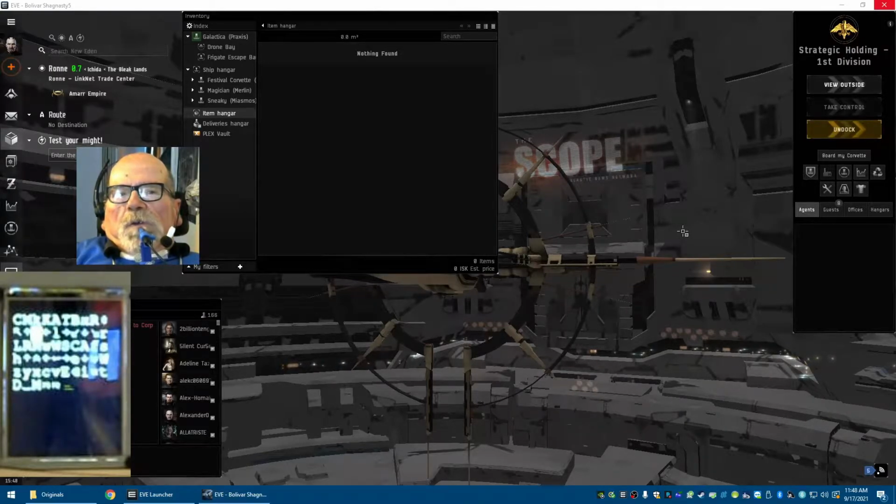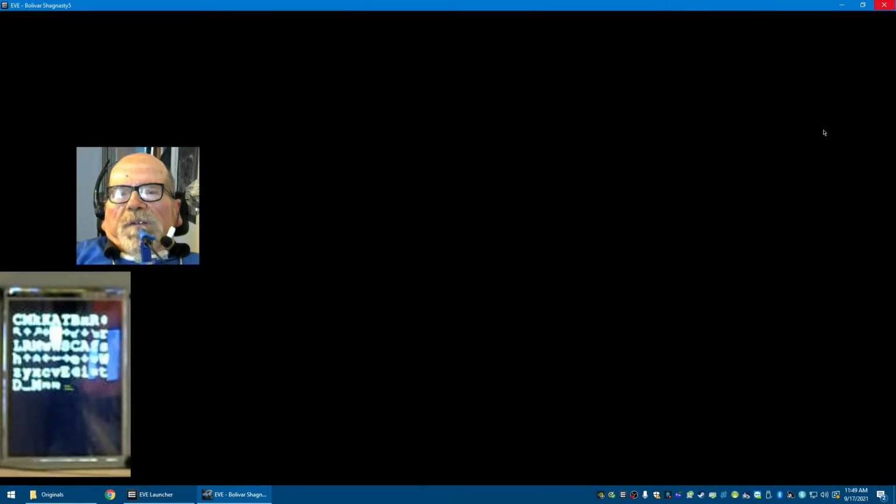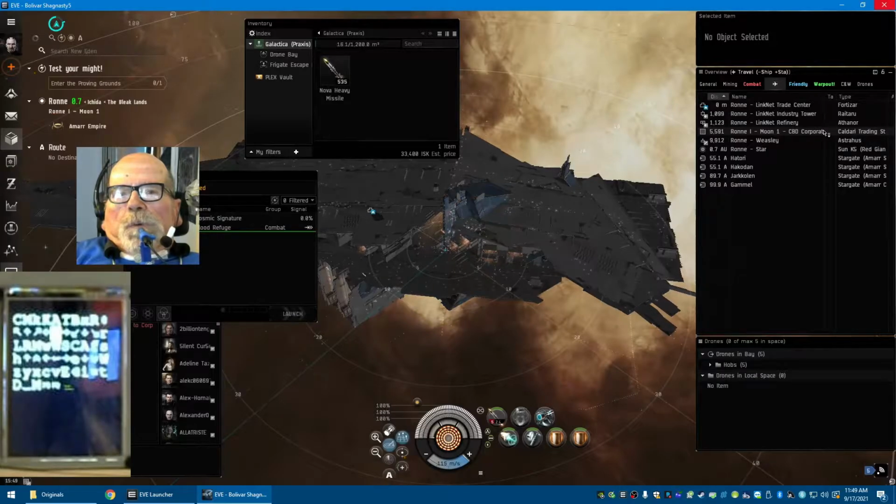Now I switch to a diagonal move. Go over this way. Switch to horizontal right. Go again. And then that's lowercase l right there in the middle is a left click. Over here, there's a lowercase r that is the right click. We're going to left click and undock. As you can see, this would be really difficult to do.